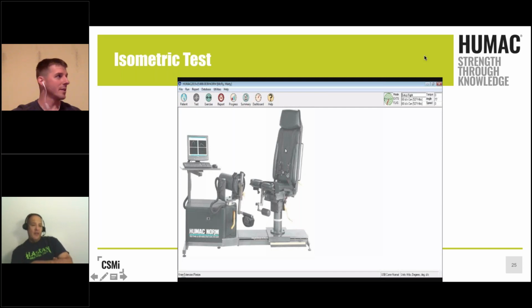Absolutely. And that's the big reason that we want to test. Yeah, and you can go back to different training modules or episodes that we've done because you don't just have your total knee patient walk in day one and test them. You run them all through those various stages of the rehab and you test them later on when it's appropriate.